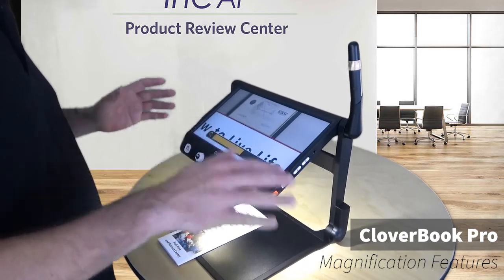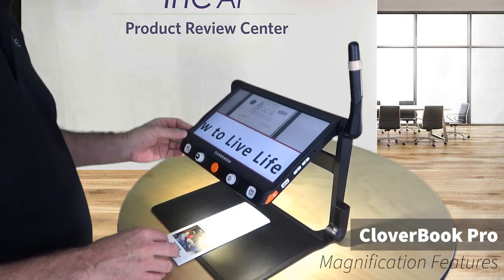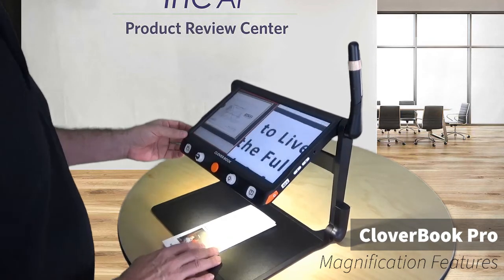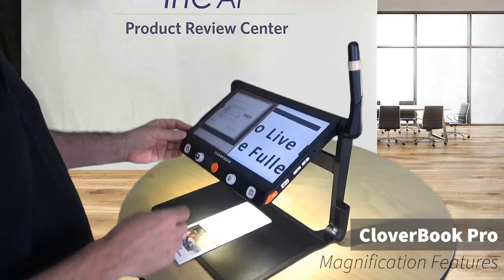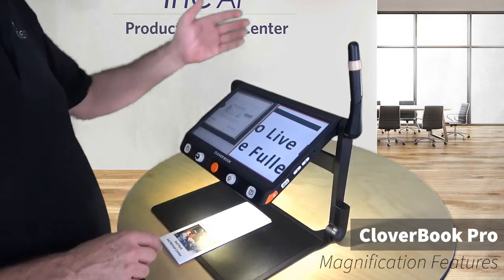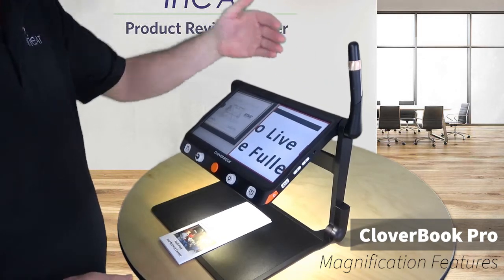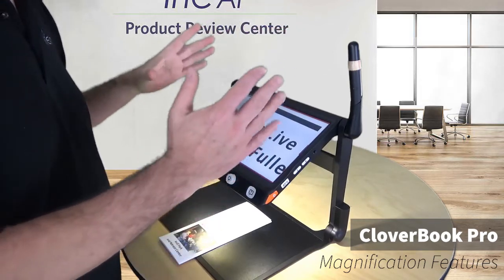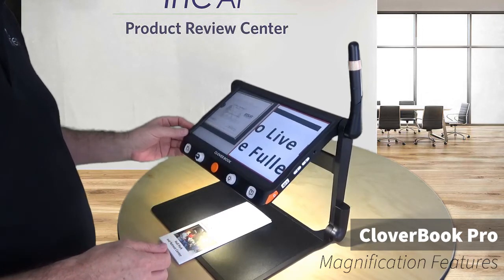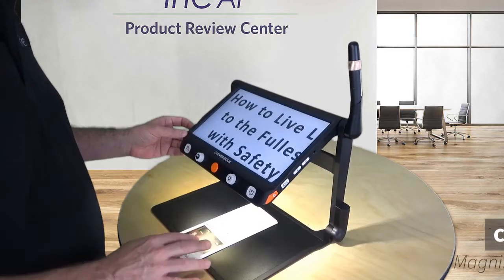So here I have a horizontal split. If I press the camera button on the left side again, this is going to give me a vertical split, if that's a more convenient view for you. Again, I can control each view independently. And I do have an option of a second 12.5-inch screen that I can attach to the device up here. So it's a physical split screen, where I get one view on this screen and one on the other. I can really take advantage of this feature. If I press it again, I go back to my live reading mode.